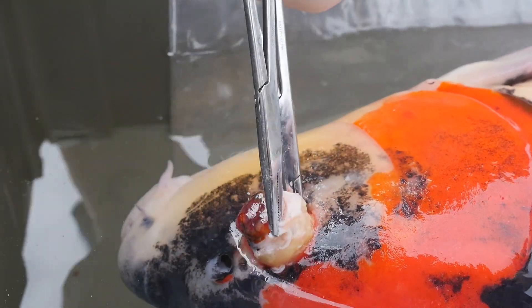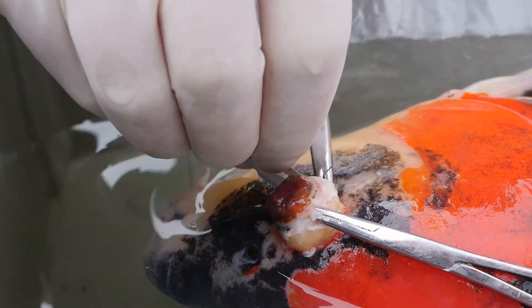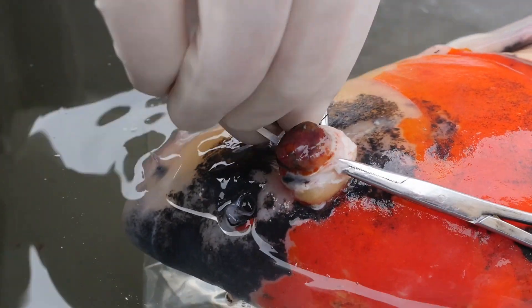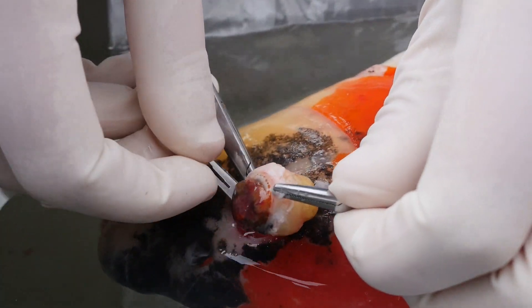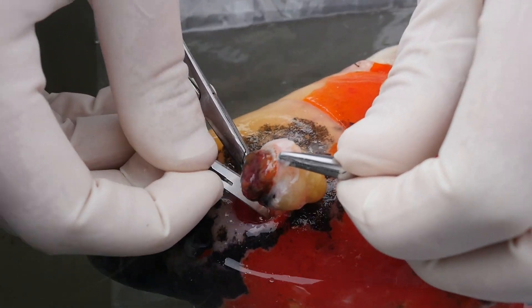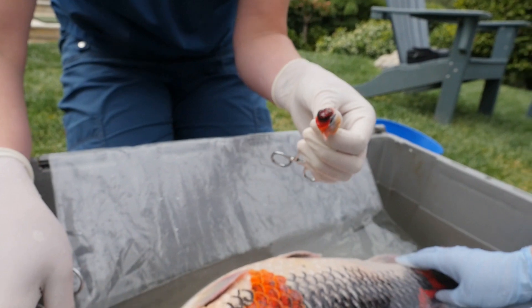Moment of truth. The side itself was left open. This is a good clean pond and we know their water chemistry is perfect, so he's going to go ahead and heal up in his pond over the summer. As you can see with the other side that we did a couple years ago, skin will start to grow over, and by this time next year you're not even going to know there was an eye ever there.